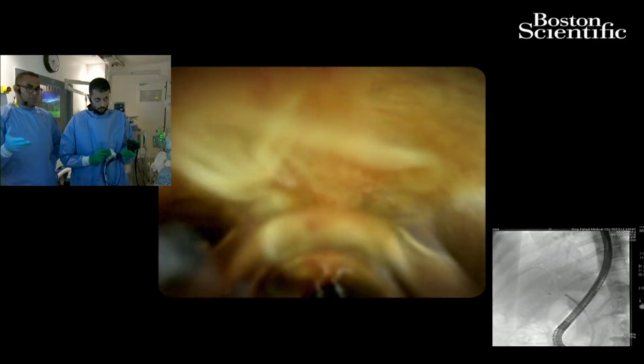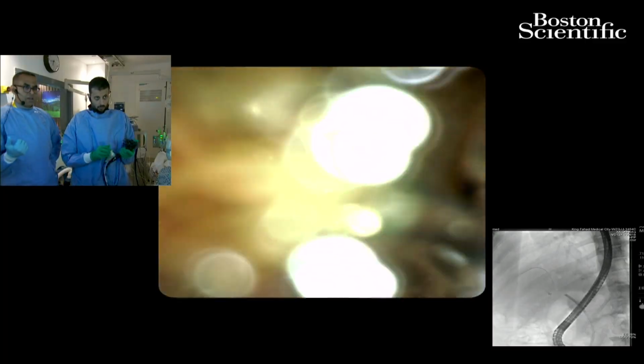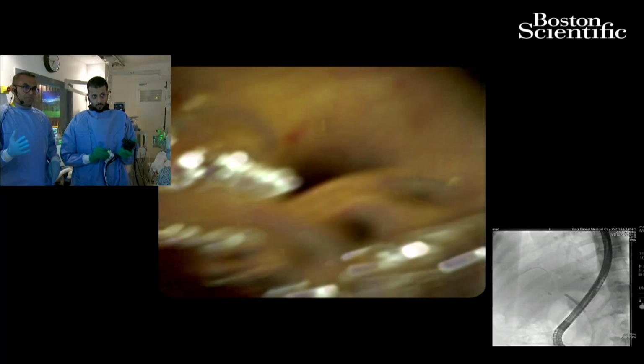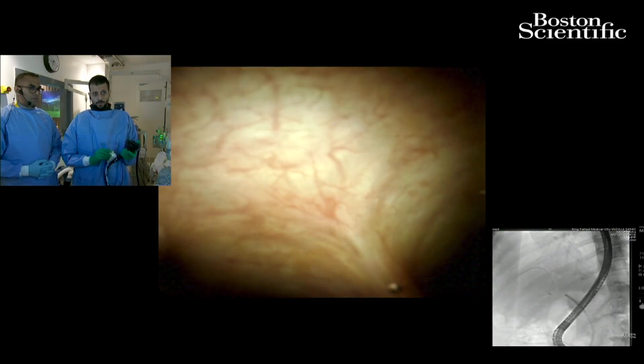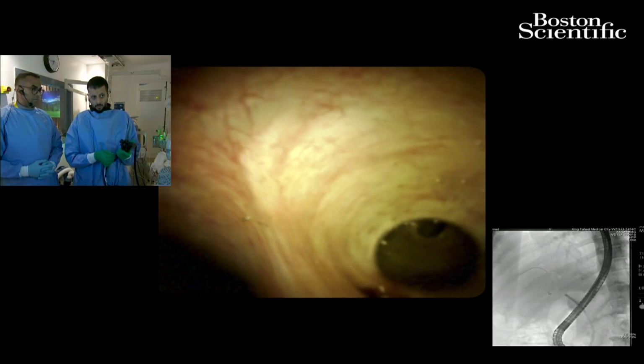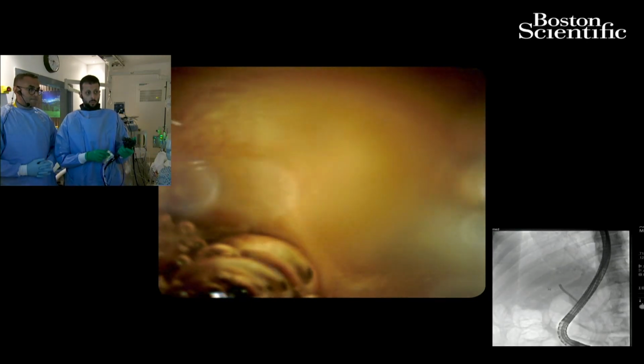But that doesn't mean, if you suspect anything abnormal, you shouldn't take biopsies using the biopsy forceps. We're going to go back and focus on the stricture of interest. Do you think this is a benign or malignant stricture? The one I see right now? Yeah. Dr. Ahmed. Yes. This is Ibrahim Mustafa.